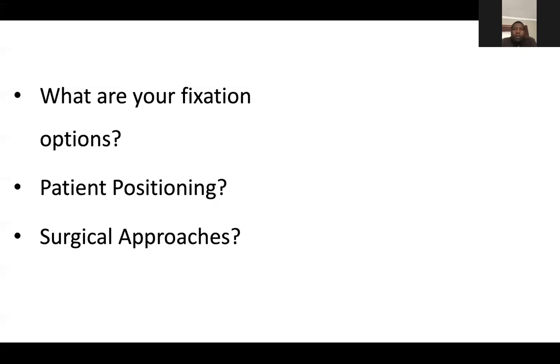Hello. Yes, can you hear, Brian? Yes, I think there is a need for a point of correction there on what Dr. Mugodo is mentioning. In a fracture like this one, you'd want something that is collinear with the trajectory of the shaft, which is what Dr. Mlala is actually trying to mention. Those are the pros for putting a nail in the piriformis. Actually, with the trochanteric entry nail, you may risk malalignment into varus. So, Dr. Anya Wunji also didn't mention, is this nail a retrograde or an antegrade nail? In terms of options, which one are you choosing and why? Well, like what Mr. Vera is trying to probe into asking.